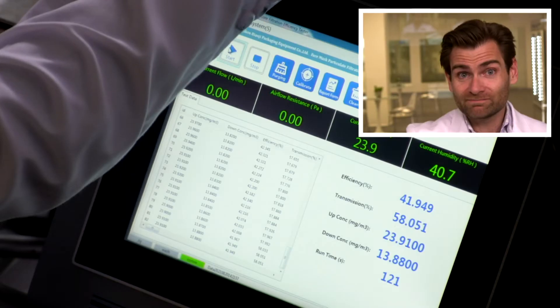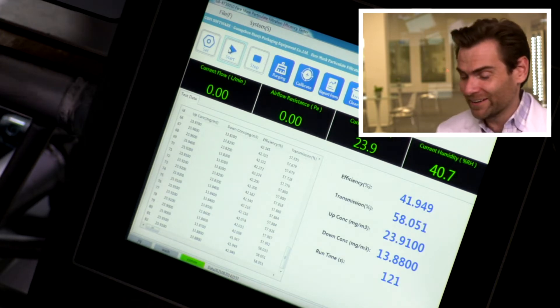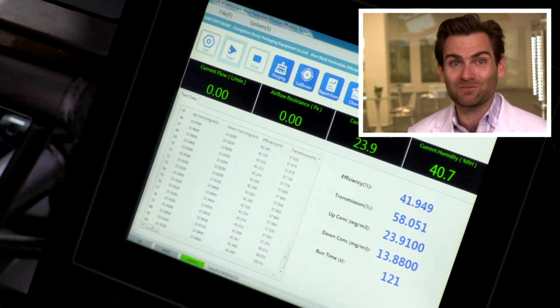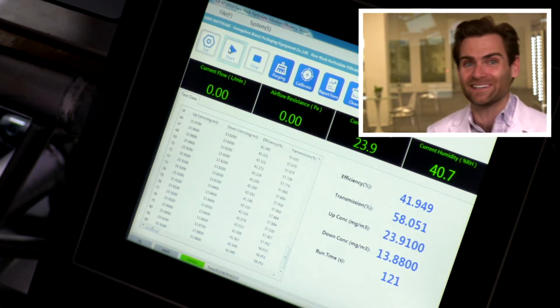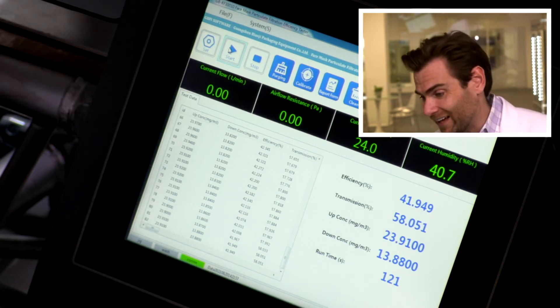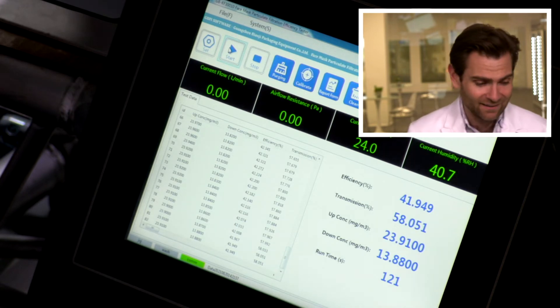Let's check out the result. I shouldn't be excited, but we've just been testing masks that are way too good today. I was just saying I want to find one fake. I don't know, it feels like I'm doing something for the world. 41.949. That is a fake.